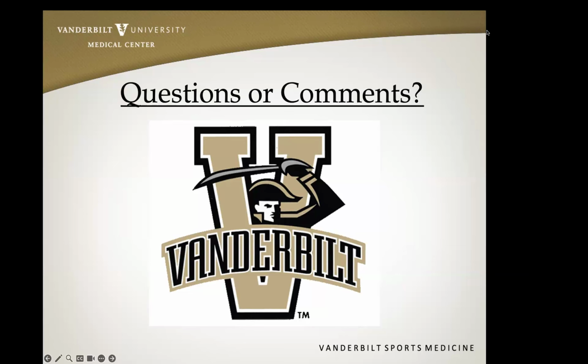Baker's cyst ruptures can also present very similar to this sort of injury. Oftentimes these patients are already improving before they get into the clinic, but it's certainly something you want to evaluate. Do you see a bunch of edema and hemorrhage because someone ruptured their Baker's cyst, or is it really because they tore something?